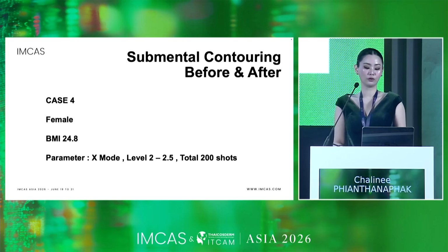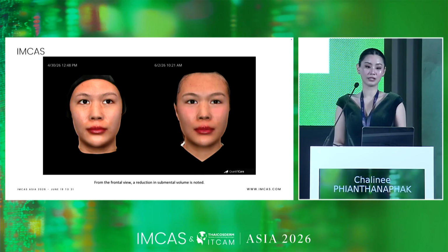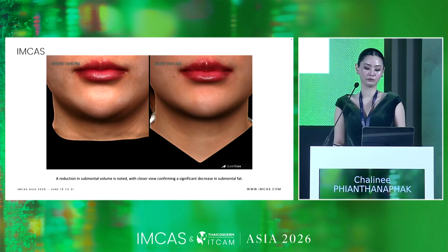In case 4, we can see a reduction in submental fat also. In the closer view, we can confirm a significant decrease in the submental fat.